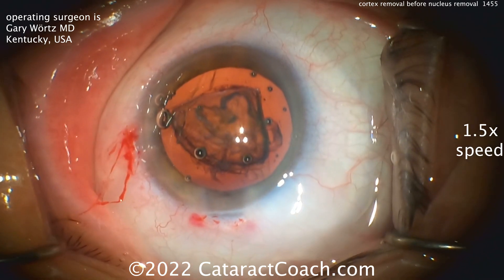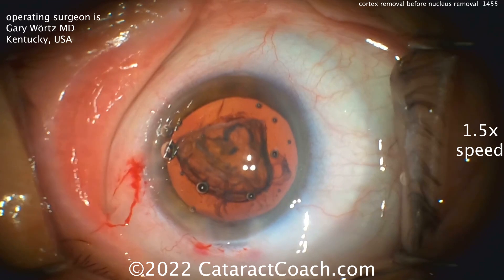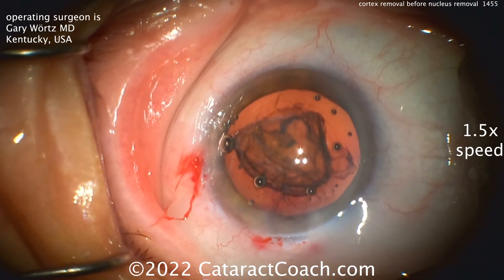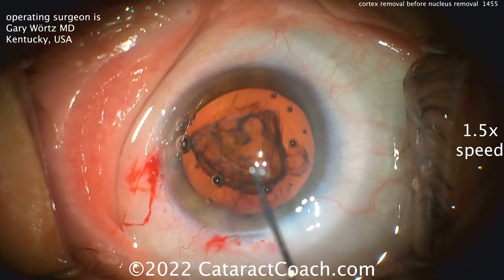Now with one quadrant left in, he's going to put the IOL in the bag first. So a very different way of thinking. I admire that — thinking a little differently and on the fly. As we would say, MacGyver it: think of an unusual solution to come up with a good plan for this patient.